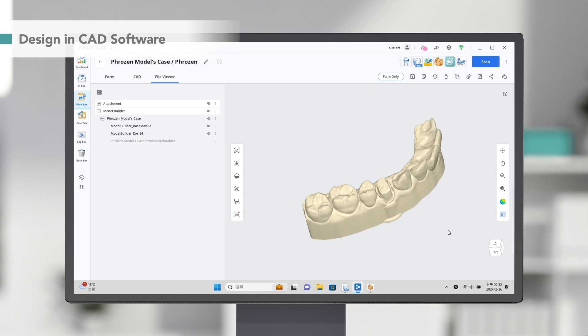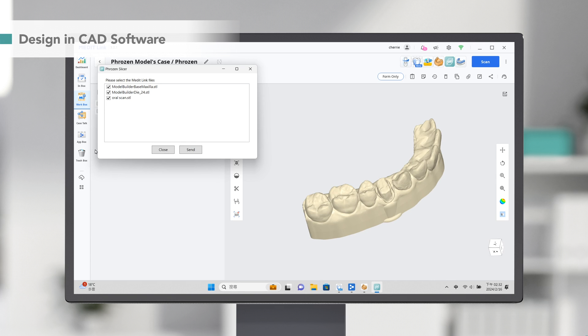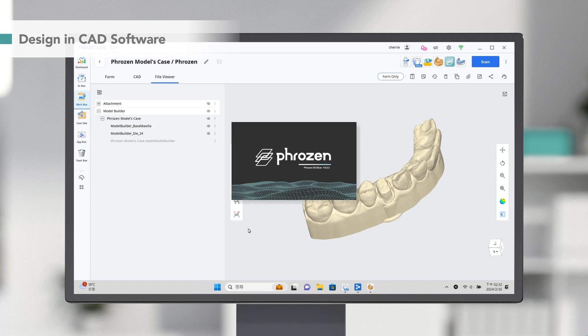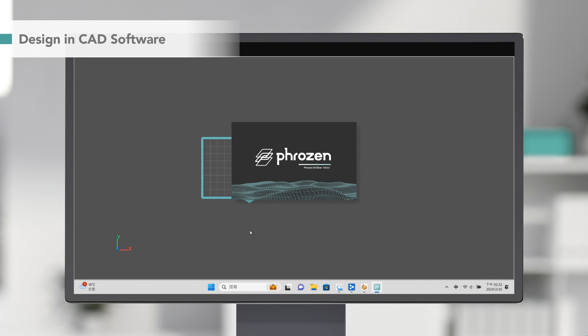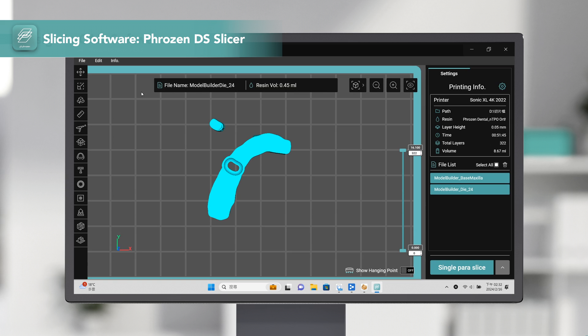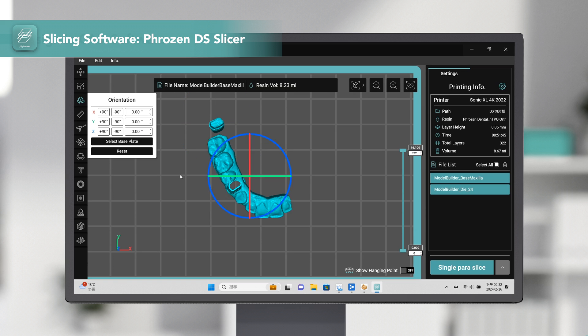Once we are finished with the design process, we'll use Frozen DS Slicer to turn the scan data into a ready-to-print file. Medit's CAD software allows you to send the scanned data directly to the Frozen DS Slicer, where we can see the die and the model.